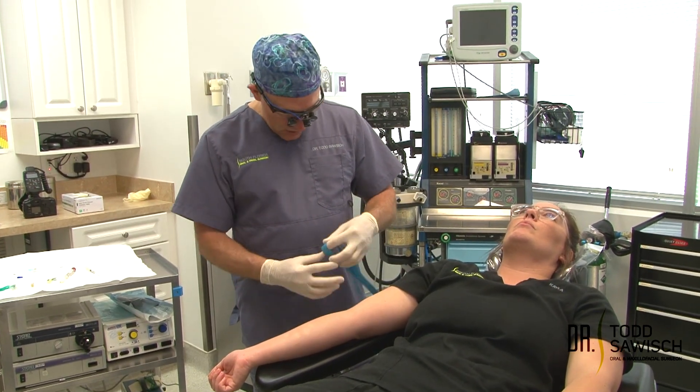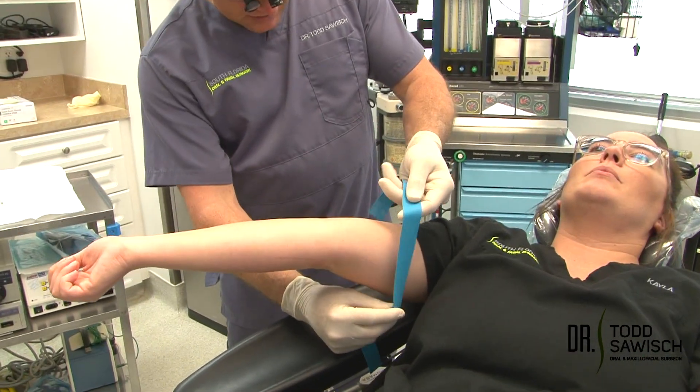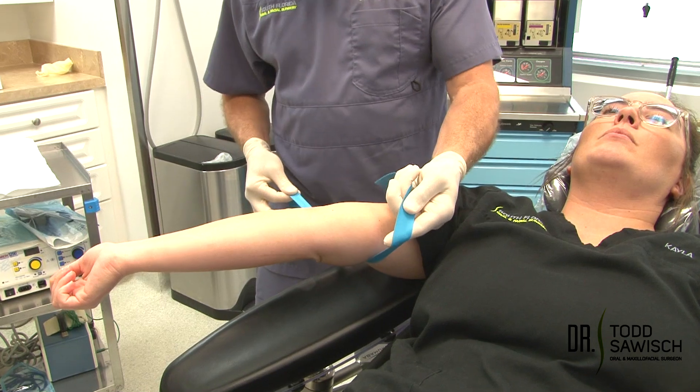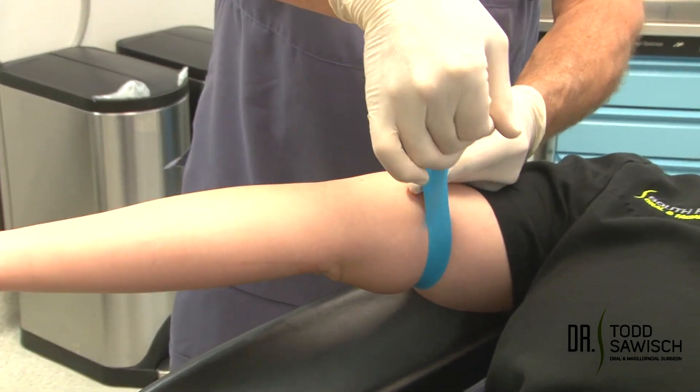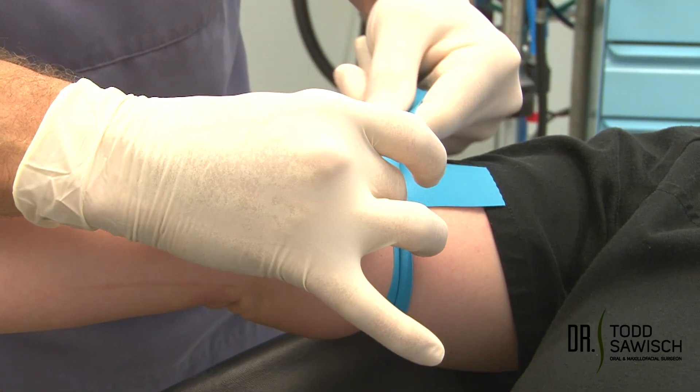First we're going to put on a tourniquet and have the patient lift up their arm. I'm going to put this on the inside of the arm. I like to pull tight over here so it doesn't pinch the skin — I pull up over, I pinch, I then place this underneath, then let go.